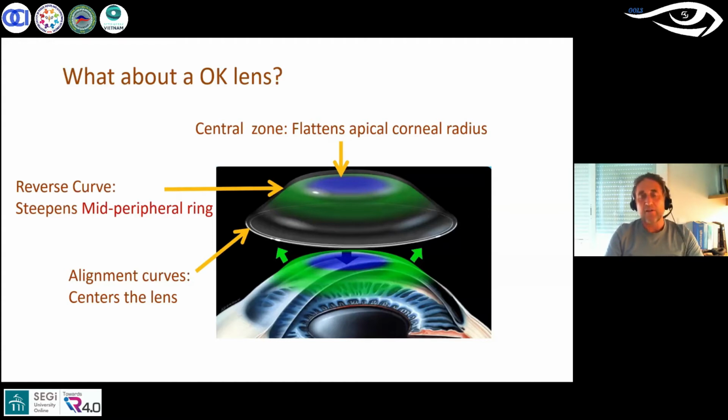The point here is that that will be the initial conception of OrthoK, but today we understand that the change of the shape is responsible for the change in optics in the eye, and is responsible for myopia control. So we know today that changing the shape of the lens, changing the way we modulate the changes of the epithelium, can help to improve our results in myopia control for the future.